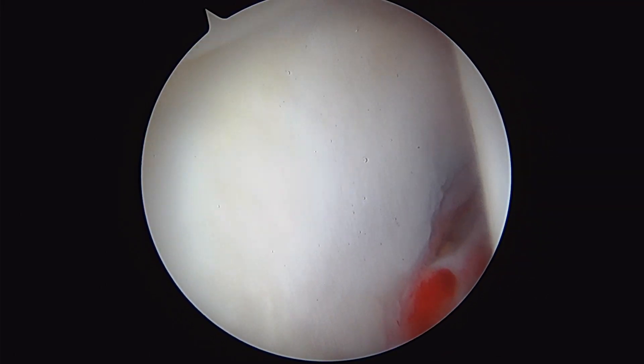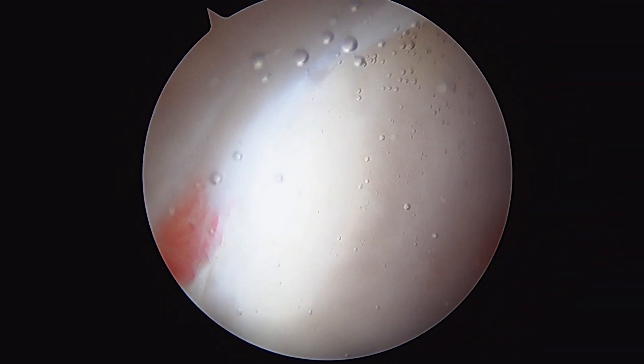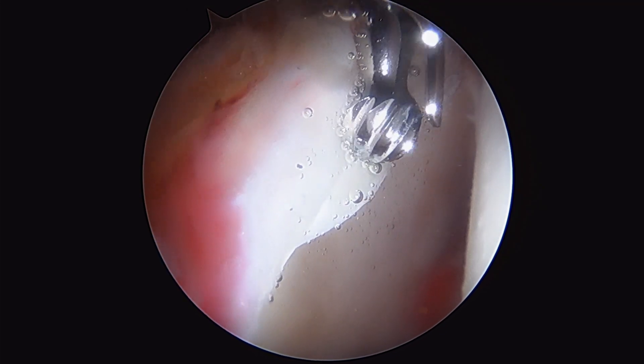So this is the right hip. We're performing right hip arthroscopy here. This is the femoral head, acetabulum, and labrum. We've already identified our labral tear up here with some chondral delamination.